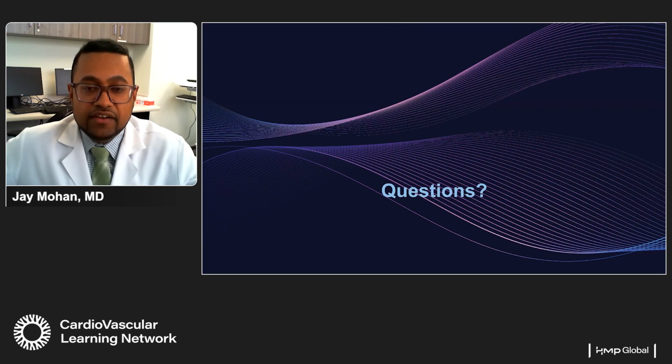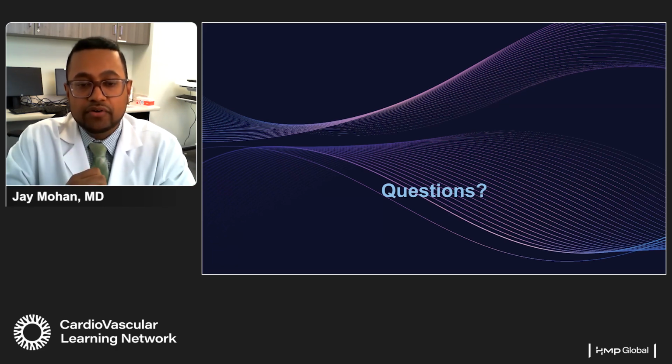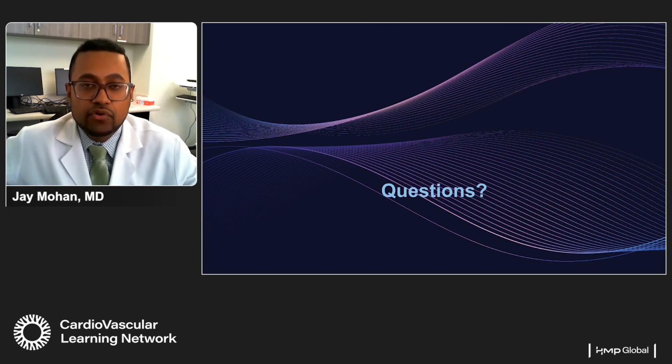So at the end of this, I basically wanted to tell you why shockwave has become so amazing. It's not really the effect of the actual stenosis. It's the effect of how we are actually changing vessel compliance. So we're taking a stovepipe artery and making it more compliant, with an ability to accept our sheath and move it up safely into the aorta, allowing us to safely perform these procedures and avoid our dreaded complication, which is access related.